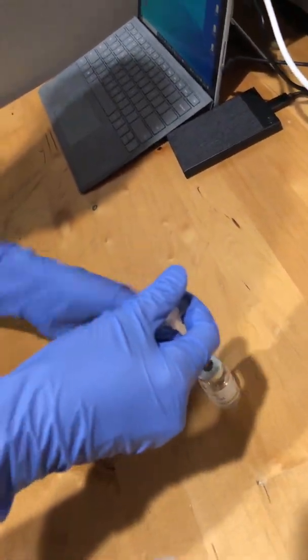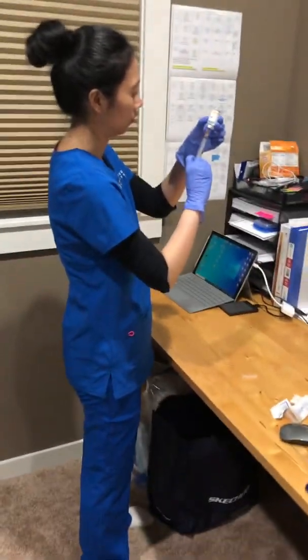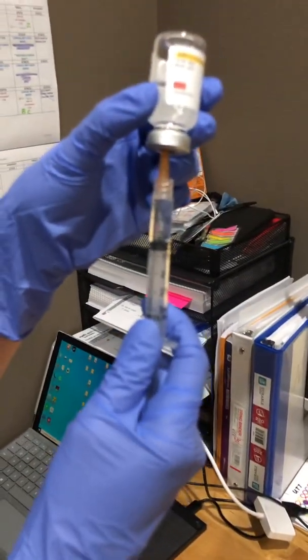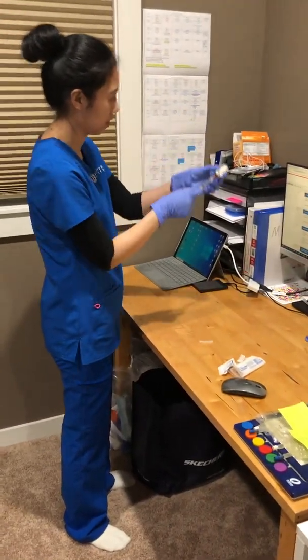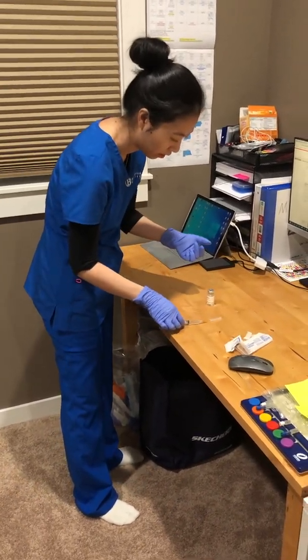Inject the air. And make sure there's no air bubble. And I draw 2 milliliters. Good. Okay, and recap it.